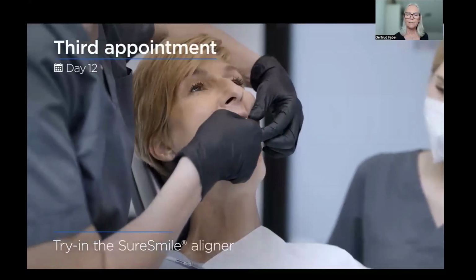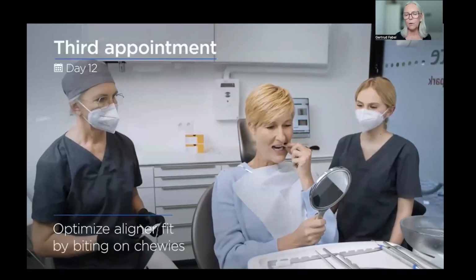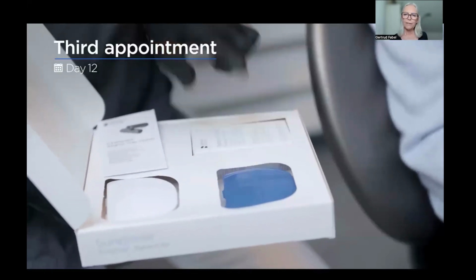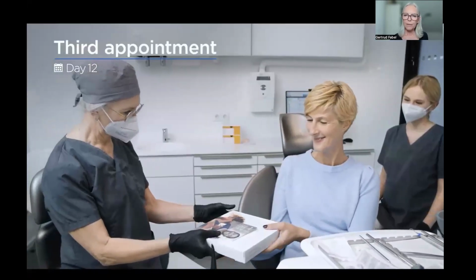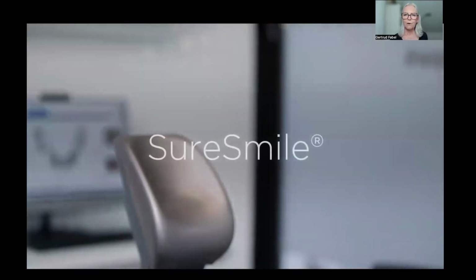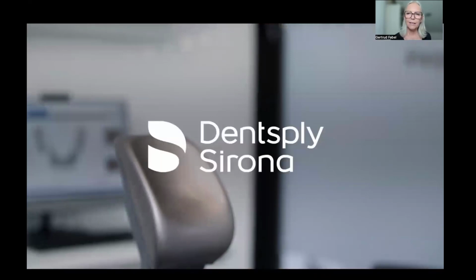Well, and we have to give advice to the patient on how to use the aligners, how to wear them, and how long: 22 hours per day. And if I recall to her after the first 4 aligners, and every 8 aligners, we recommend hygienic appointments. So this is how it works in my practice.